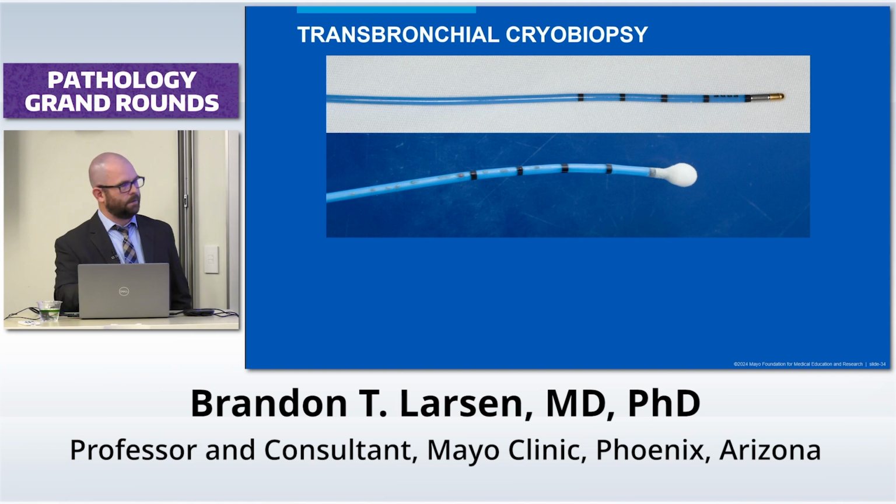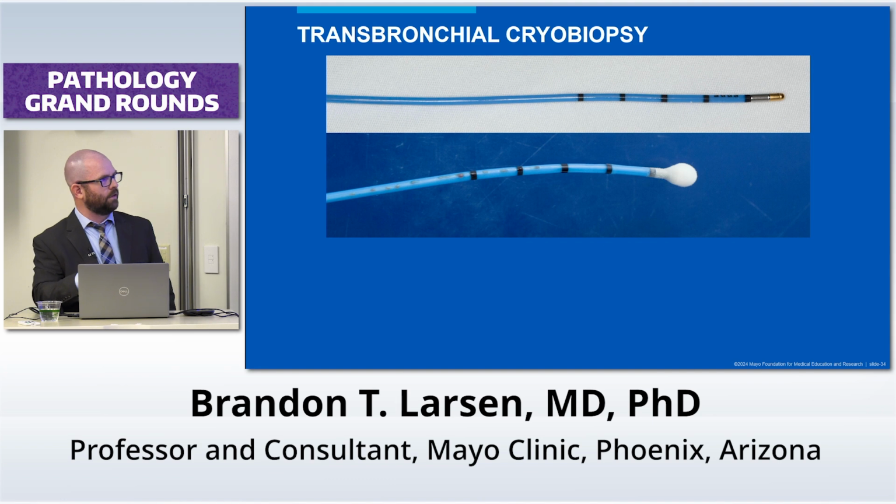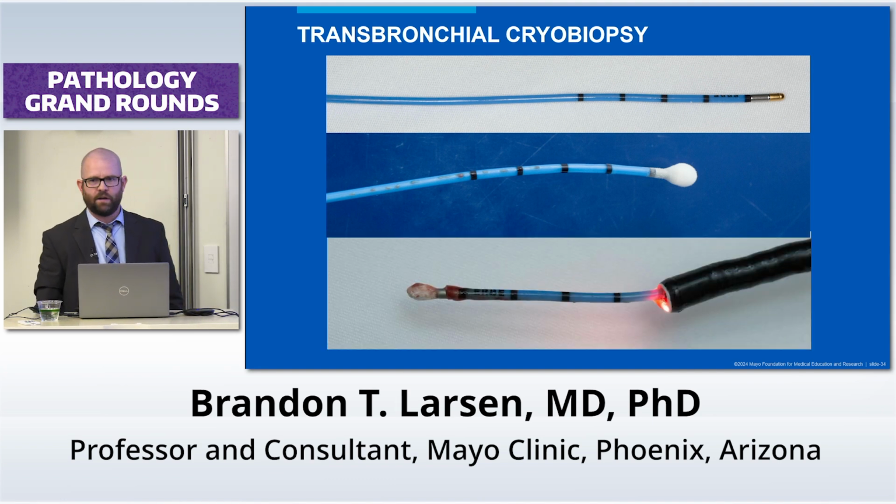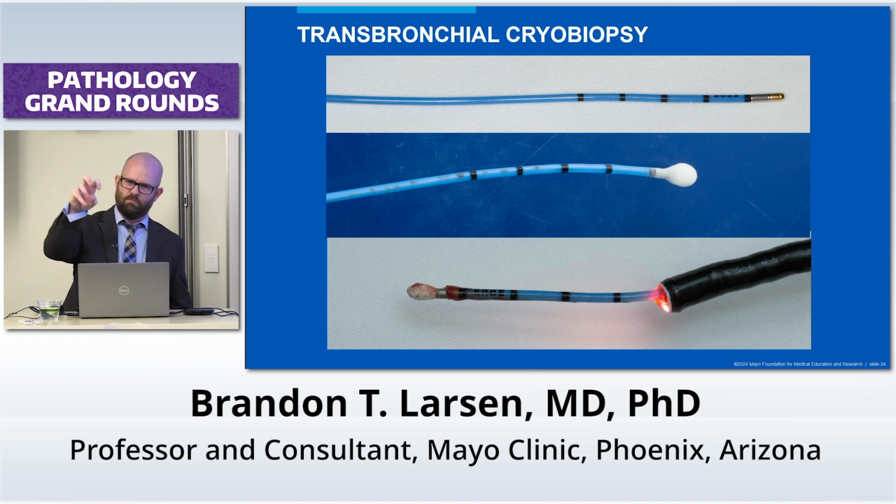It's the same idea. And then at a certain point in time, after it's been frozen long enough and the snowball is large enough, the operator will withdraw the bronchoscope out and tear that little piece of tissue out of the lung. And because it was not crushed with metal jaws of that forceps, but it's been frozen in situ, that tissue is perfectly preserved.